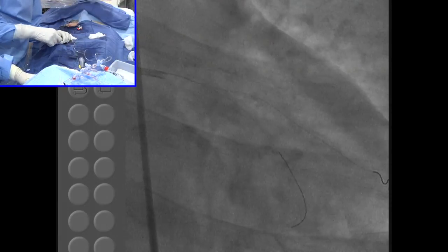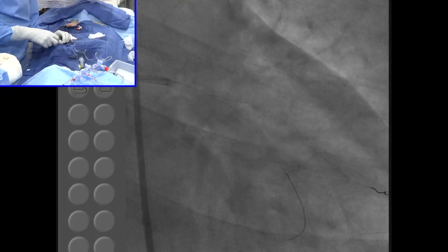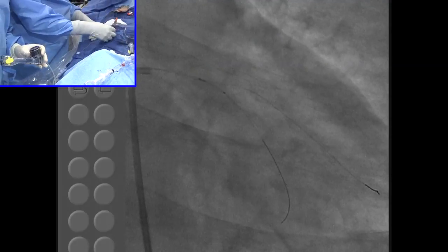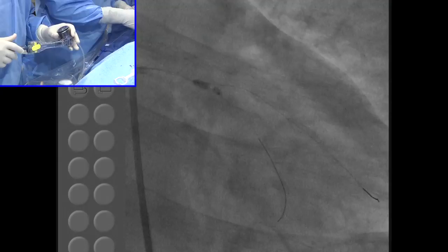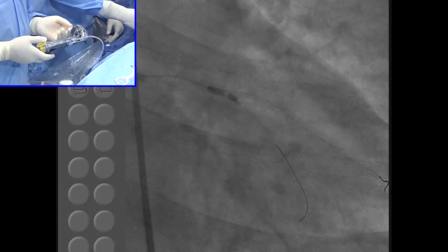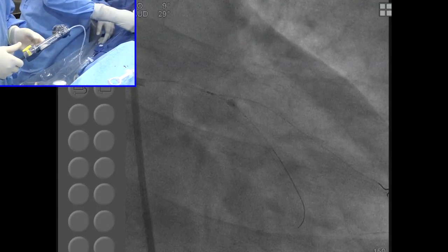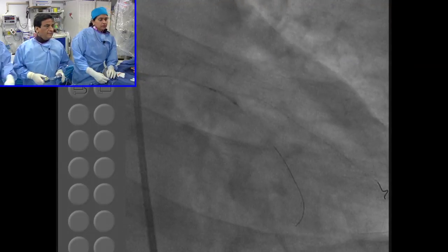You do a lot of angioplasty outside the country, I know, particularly in India. Have you tried any of the dedicated bifurcation stents? Well, actually, I've been involved, I would say, in 2 of them. In the live case with the CSI, particularly Access Plus. Yeah, and there is one more available, but 2 of them. But to me, again, very complex, because Access Plus stent itself, then you put additional 2 or 3 stents. So the Access Plus is the one which people are using at present.